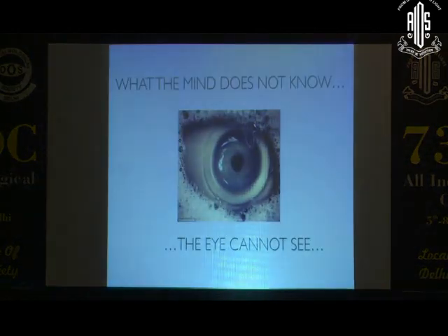So basically I think the utility of the OCT, especially during surgery, is the fact that there are a lot of things that you really can't see during surgery, especially in lamellar corneal surgery. The OCT is going to allow you to see a lot more than what you imagine. So I think that's the big thing about the OCT in surgery.